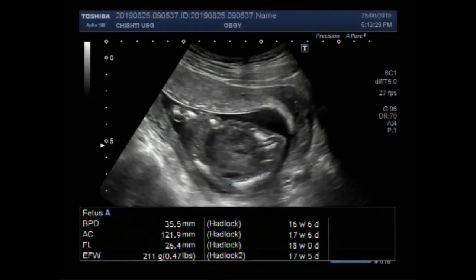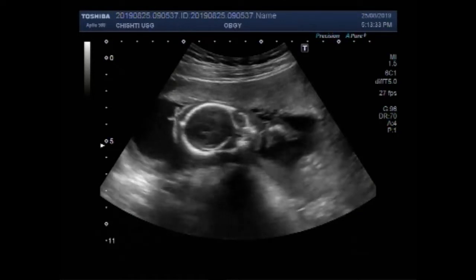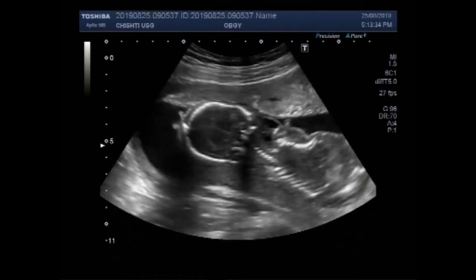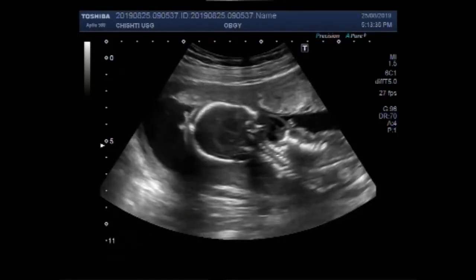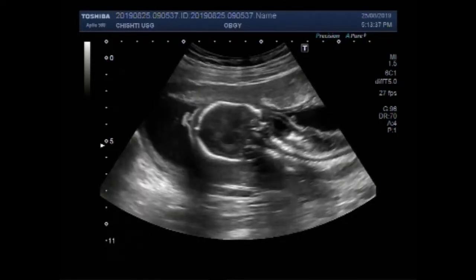Dear viewers, I hope you are all fine. This video shows a pregnancy with fetal demise and multiple fetal anomalies.